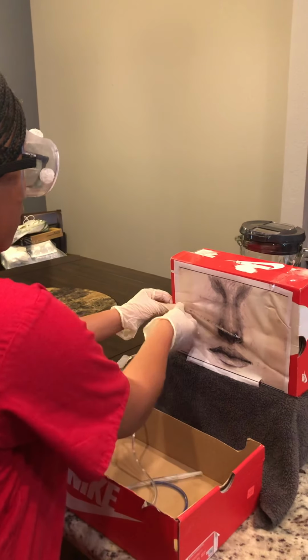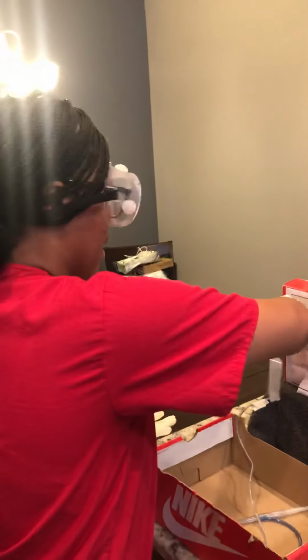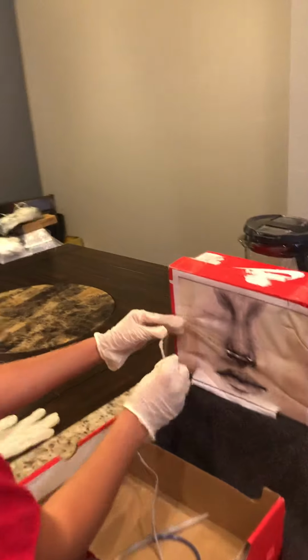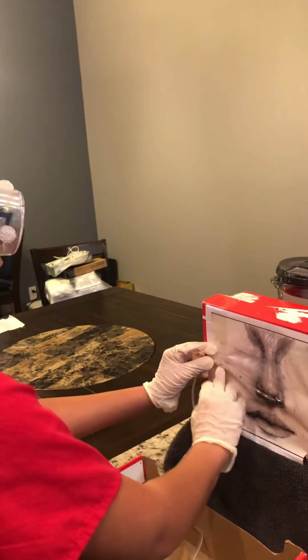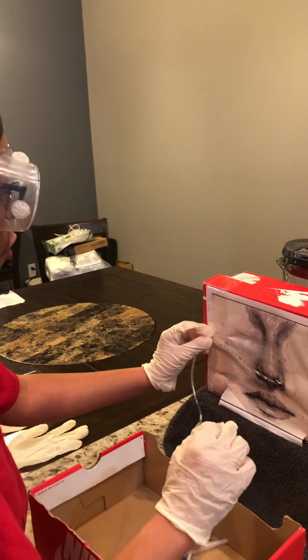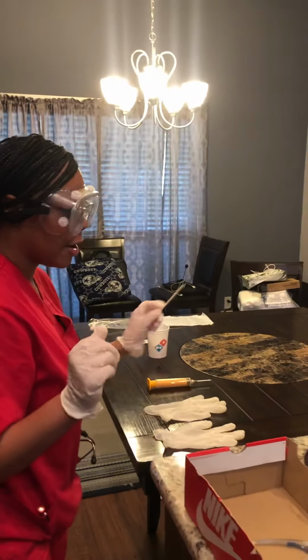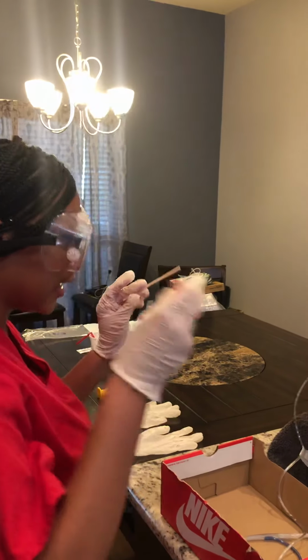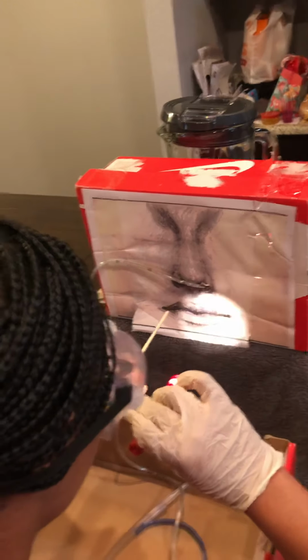Next thing that I will do is secure my tubing with my temporary tape against either my patient's nose or cheek, and in this case I'm choosing the cheek. Once the NG tube has reached its marked placement, I will then use my penlight and my tongue blade to check the position of the NG tube in my patient's throat.